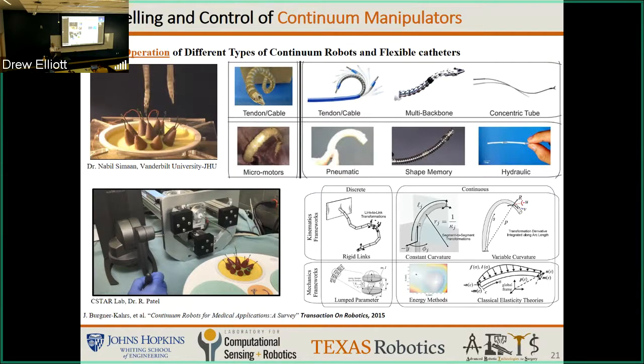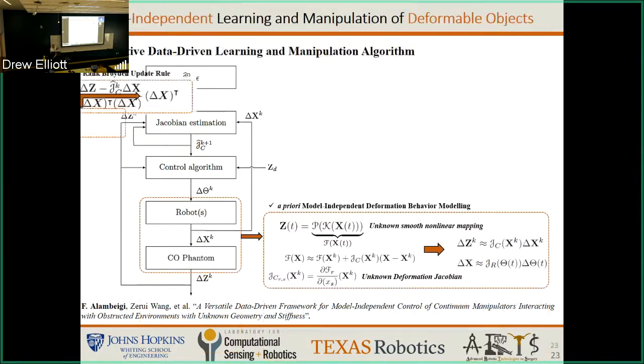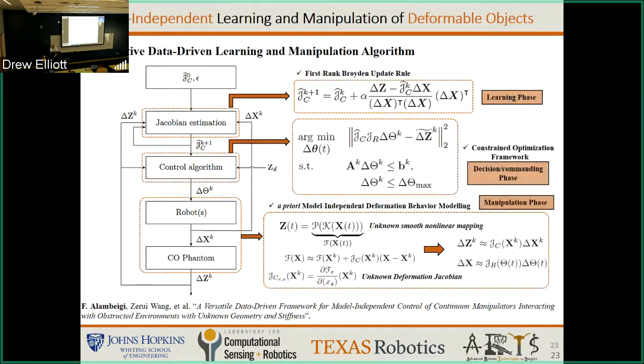Similar to the literature, there are different approaches here, and we said, let's try the same concept of the deformable object, the same algorithm. Here, we imagine we have a deformable robot. We can measure some points, like the shape or one point along the shape, and try to control the robot with the same algorithm. I want to just skip this.